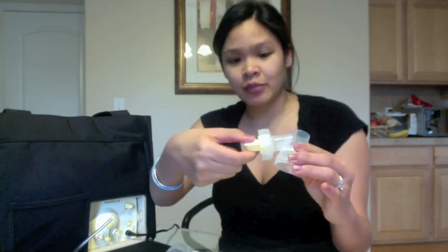This is what the pump itself looks like, and it comes with, depending on which one you get, a couple bottles and everything. So you want to just make sure you boil everything for about 10 minutes. You do want to pull everything apart. It does come pre-assembled, so to show you how to take everything apart, you just take off the breast shield, so that's one part. And then you want to take the valve, it's this yellow part, off, and basically you just pull, or you can even twist it off.